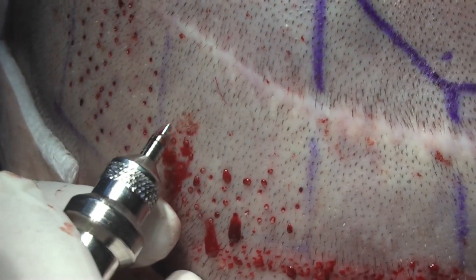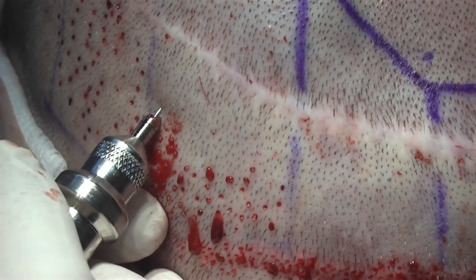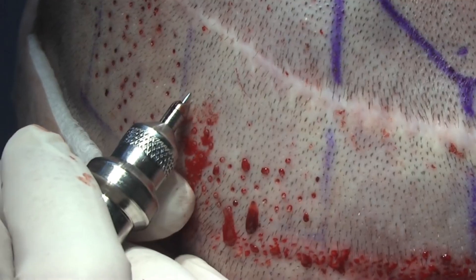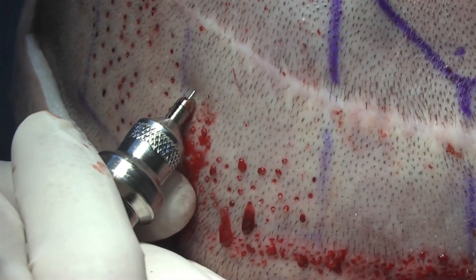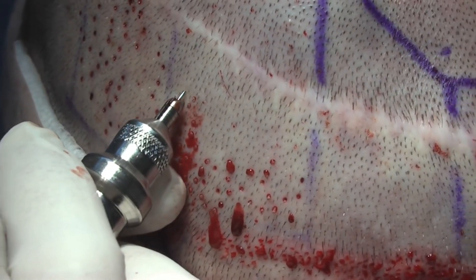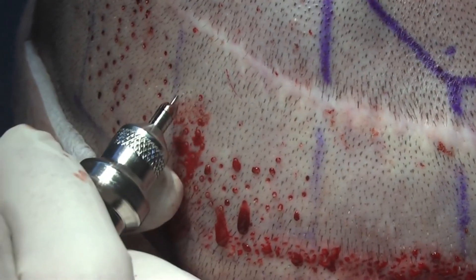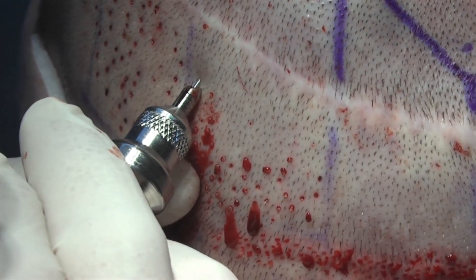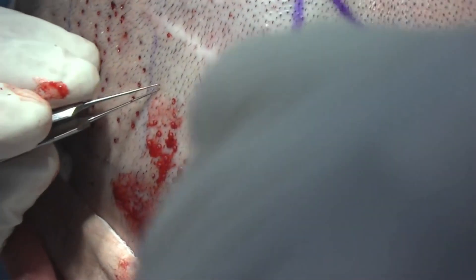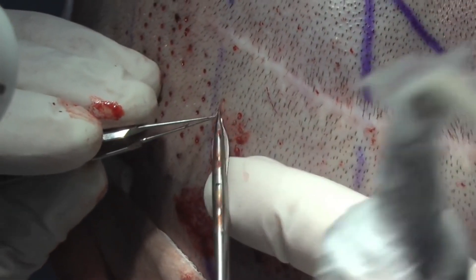Rotation followed by oscillation is valuable when you must make a deeper incision to extract the grafts, due to a firm attachment of the graft to the adipose or a very weak outer root sheath. It is often advisable to routinely check your grafts and make sure there is no follicle transection.